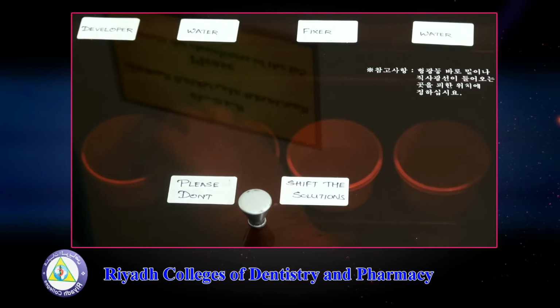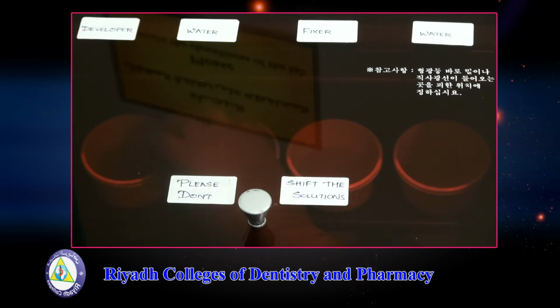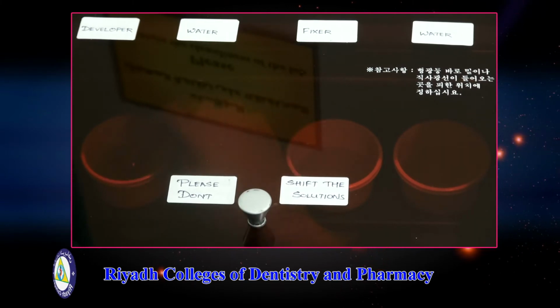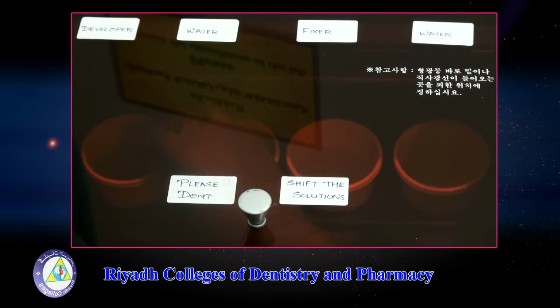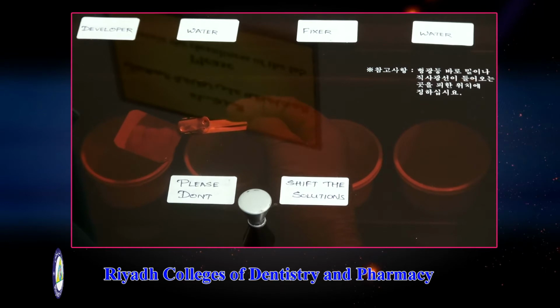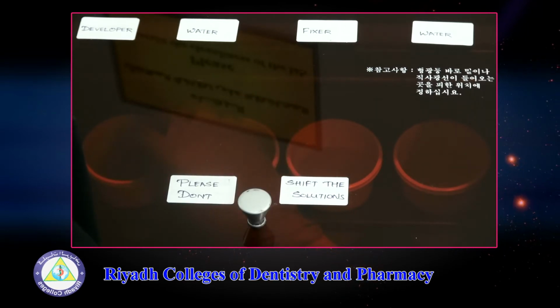Now this may vary, the time for developing may vary depending upon the strength of the solution. So now you can see that some images are appearing on the X-ray film. You have to process in the developer till you get dark black and greyish white areas and structures of the teeth are seen.